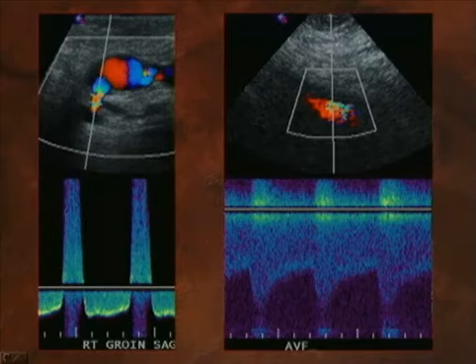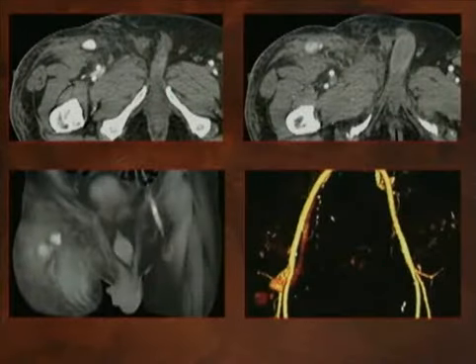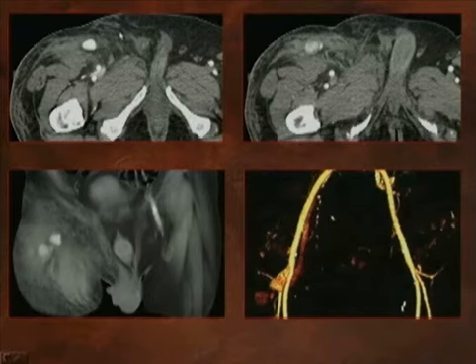Well, the patient was discharged, went home. When he got up out of bed at night to use the restroom, the pseudoaneurysm ruptured. He developed a lot of pain, a lot of swelling at the site. He came back into the emergency room and had a CT arteriogram done. In the two images up above, you can see the infiltrating hemorrhage in the groin, as well as the pseudoaneurysm lumen. And in fact, there was a second lumen of the pseudoaneurysm that had developed after it had ruptured. In this coronal reconstruction, you can see the two pseudoaneurysm lumens and the hemorrhage surrounding it.